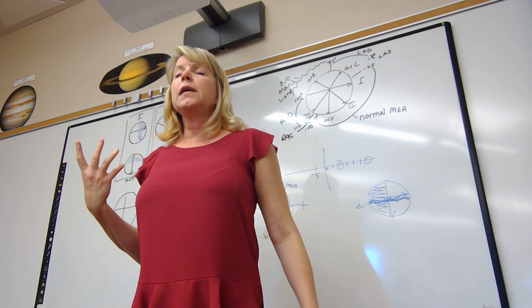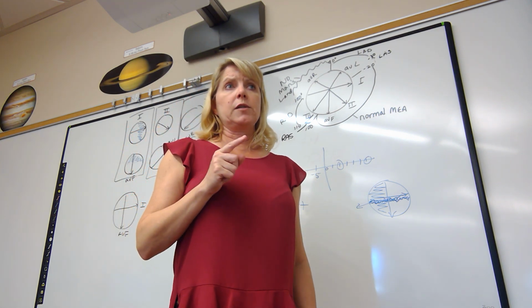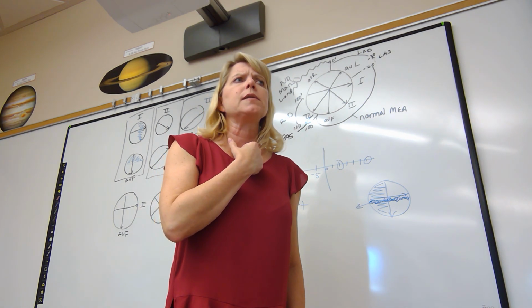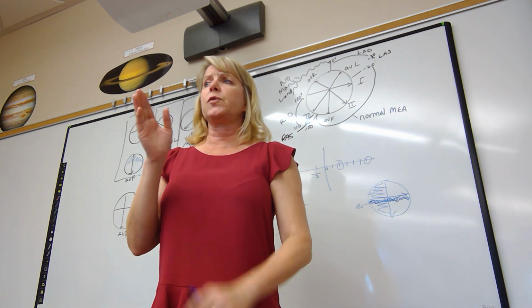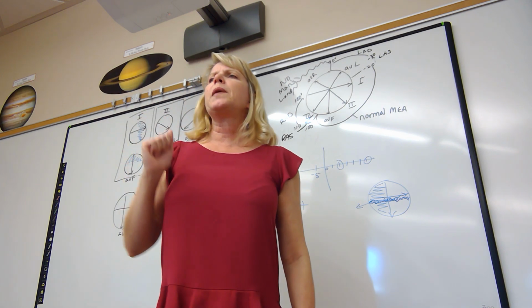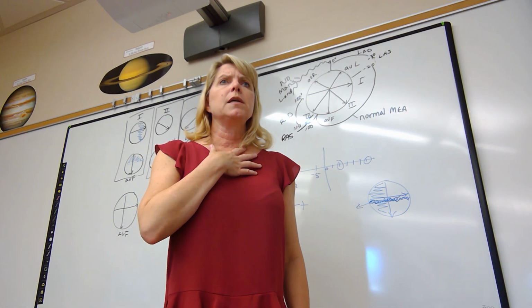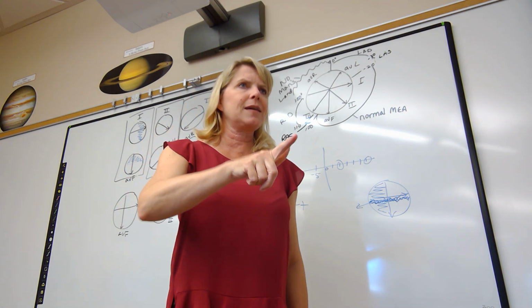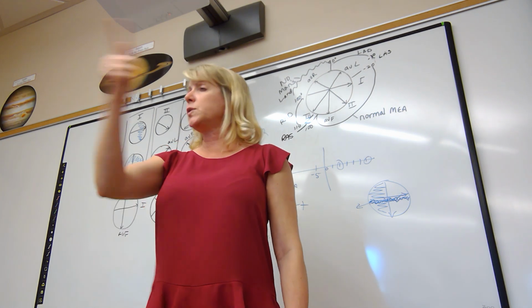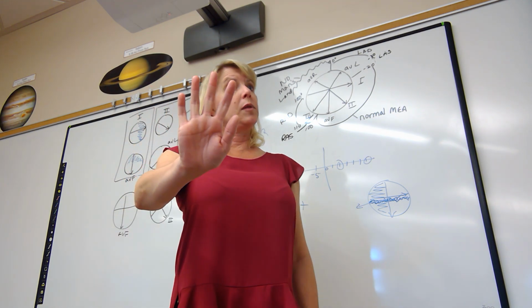Will I create a lead? No. But I did tell you, if you really know your vector analysis, if you really know your stuff, I could create any lead I want and put next to it the cardiac vectors. There are only 5 cardiac vectors I've asked you to know. You should be able to tell me if the pen goes up or down. I will not create a lead. You will be held to the 6 I've asked you to know. But if you really know your stuff, if you're studying with each other, have someone create a lead and say, now what will the pen do?